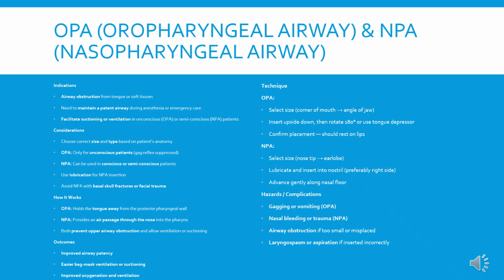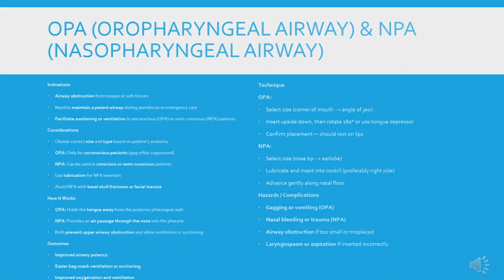Hazards and complications: gagging or vomiting, OPA, nasal bleeding or trauma, NPA, airway obstruction if too small or misplaced, and laryngospasm or aspiration if inserted incorrectly.